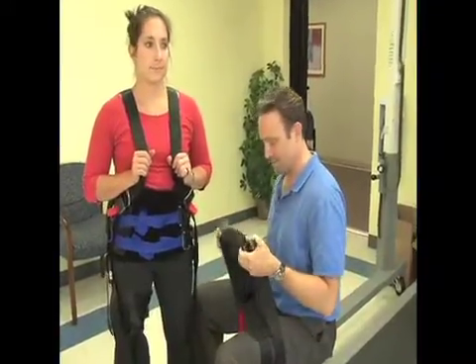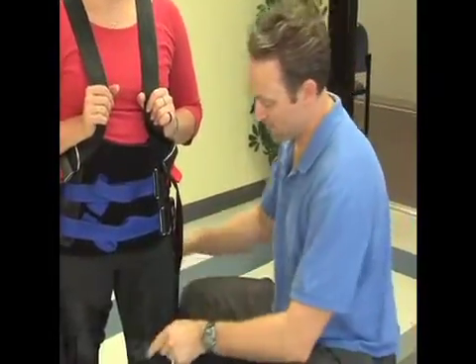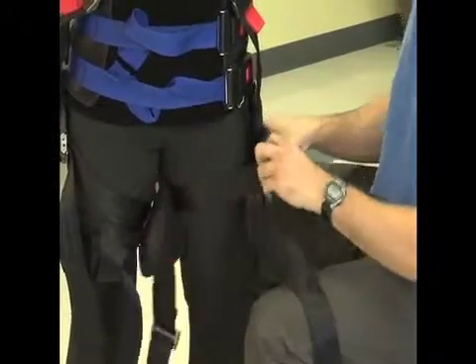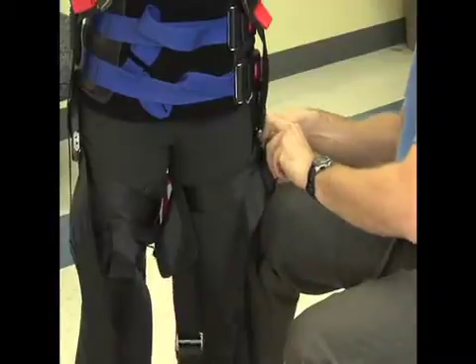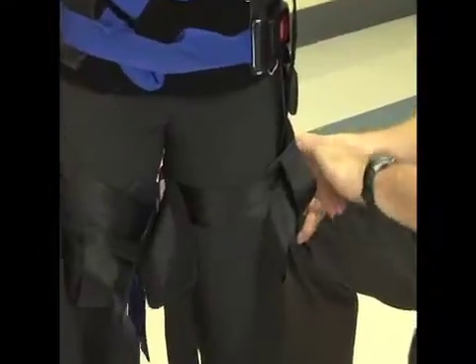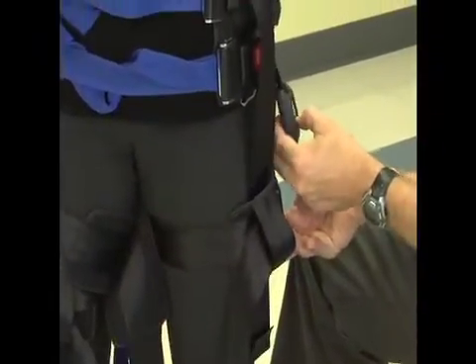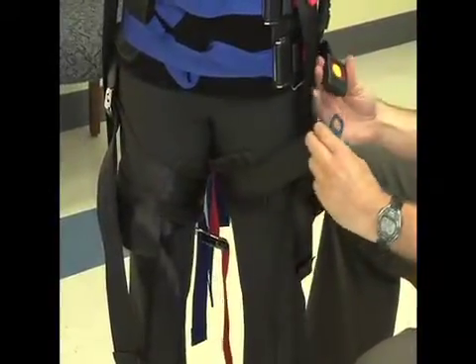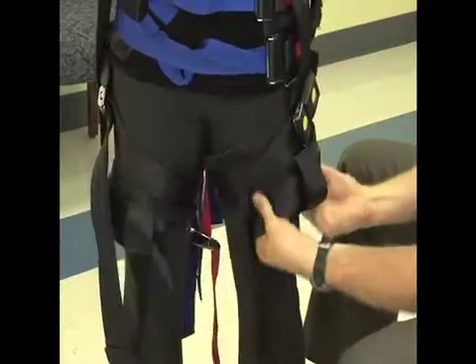The first thing you want to do is locate these two plastic clasps. The strap is going to wrap around the thigh and then we attach the plastic clasps together. As you can see on Kate, the plastic clasps are on the outside part of the leg. We're still aligning this buckle dropping down the thigh over the greater trochanter. Attach the yellow buckles and make them fairly snug — remember, this is not going to be overly tight.